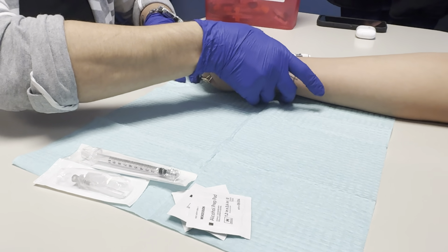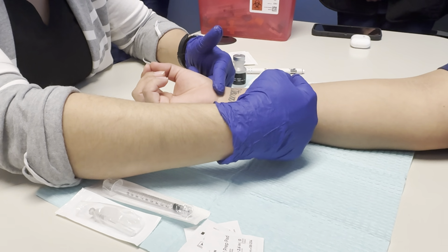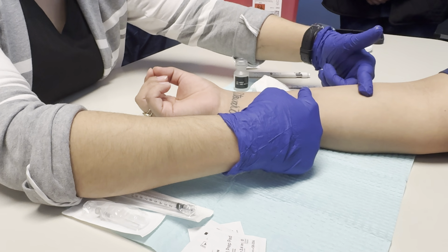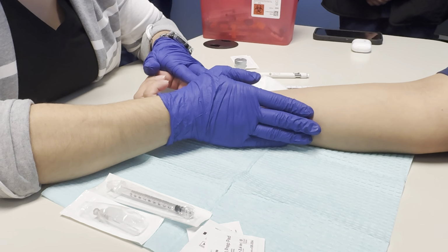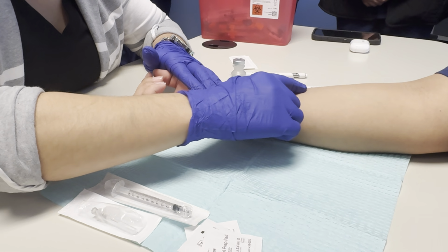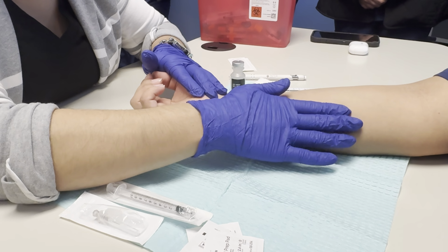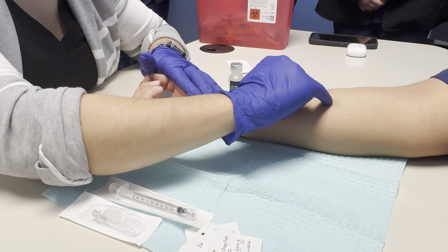Okay. So what I'm going to do is look at your arm here, and I'm going to divide that in three parts. So if I look at her arm, this is my first part, this is my second part, and this is my third part. My focus is going to be on the middle part, so I'm going to make sure that I stay around here. I'm going to observe the skin. I see a little mole here, so I'm going to avoid that. I see there's a vein coming this way, and this way, and this way, so I'm going to avoid that. There's no scarring, no heat, no swelling or anything. So my goal is to go right here.